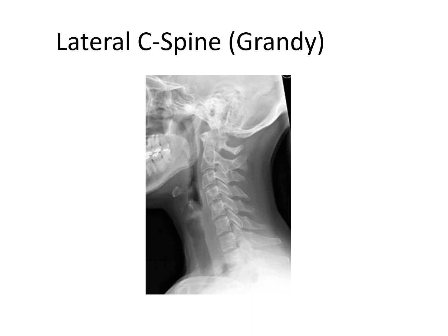And typically that's not the order. Typically the order is do the lateral first, because the lateral is most diagnostic as far as trauma, dislocation, displacement, subluxation, spondylolisthesis, those type of things. If you don't know what those words mean, please review the pathology page in the Merrill's for the spine chapter.